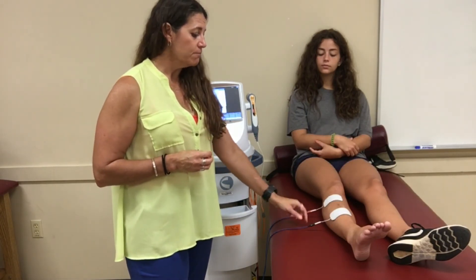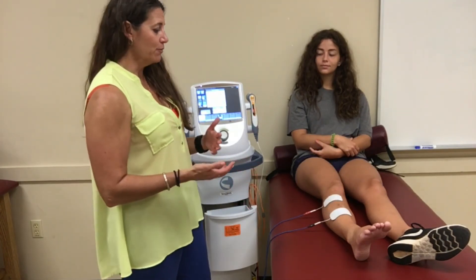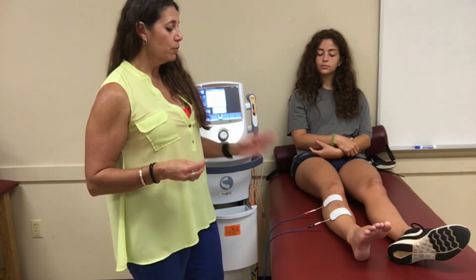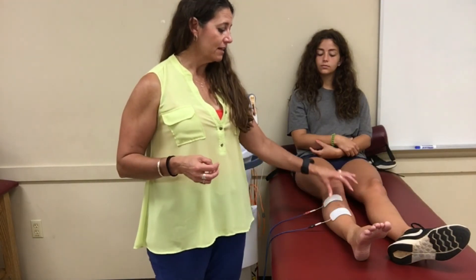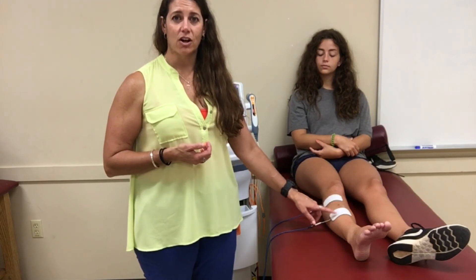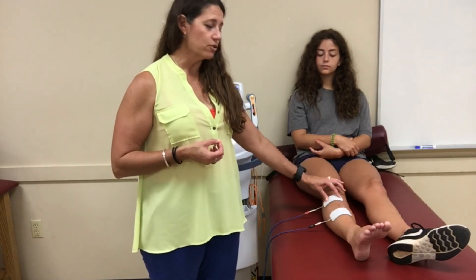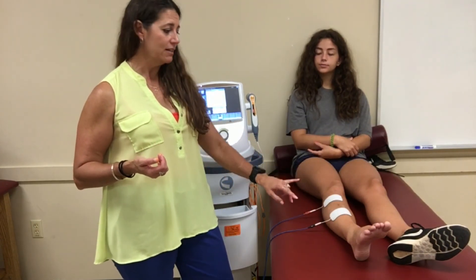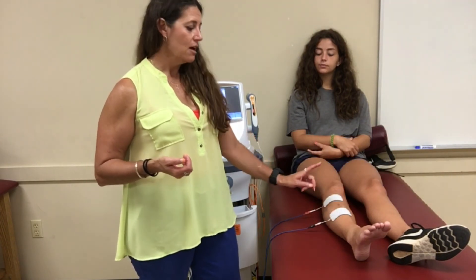Start initially with negative polarity for all the reasons discussed, and then eventually switch to positive because that helps more with clotting and finalizing the healing. Importantly, you don't want the negative or positive electrode always in the same place, because the body will start reacting and skin breakdown can occur from constant bombardment by the same polarity. So alternate them over time — for example, in the morning set it one way, and in the afternoon flip the electrodes so they're not always getting the same polarity in the same spot.